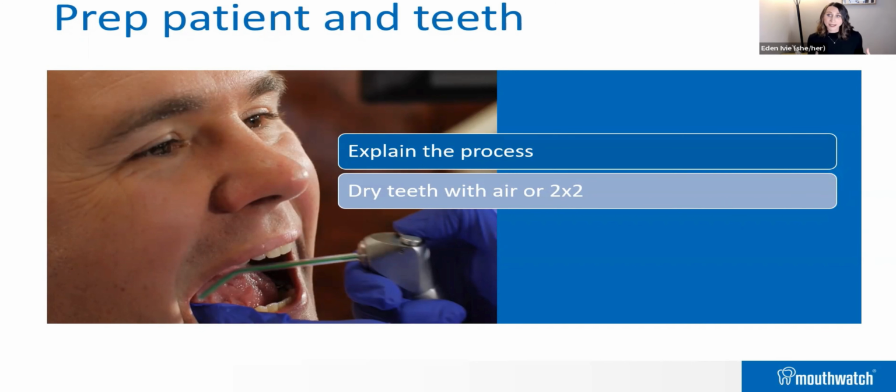If your patient has excessive saliva in their mouth, you are going to get reflection. You're going to get bubbles that are going to occlude the structures in the mouth. So it is really important to try and get that mouth dry. You can even just ask your patient to swallow, or to suck air through their teeth. If you just have them do one of these, even that will get enough of the saliva out of the way. So there are different methods and different techniques. You just have to find what works best for you and best for your patients.